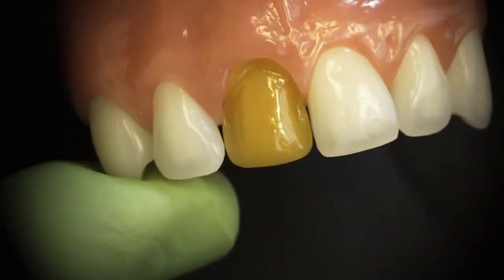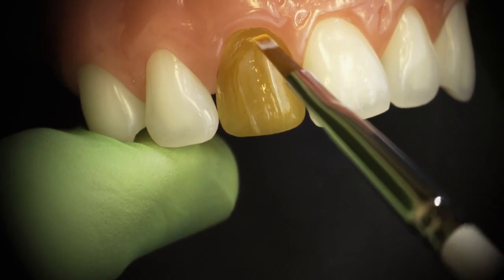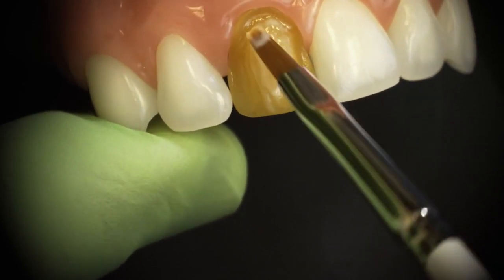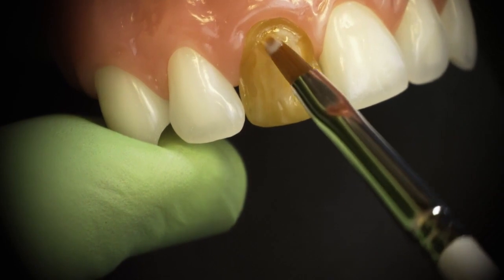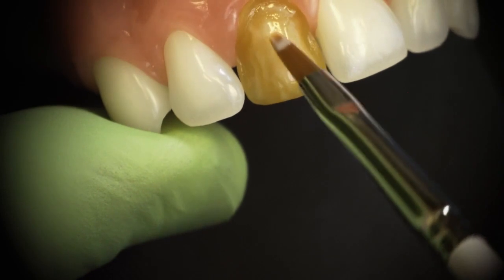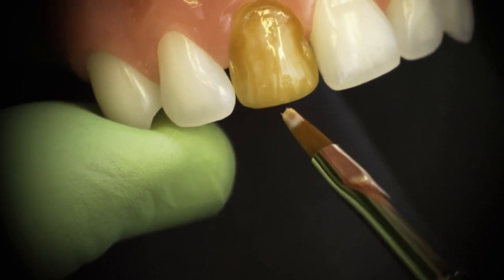The key when we're doing our pink opaking or our sub-opaking is that we want to apply a thin layer of our pink opaker over the tooth. We want to be careful not to over-opake, because if we over-opake, then the tooth is going to look really artificial. So we're placing a thin layer, understanding that we're going to be applying additional layers of the pink opaker.